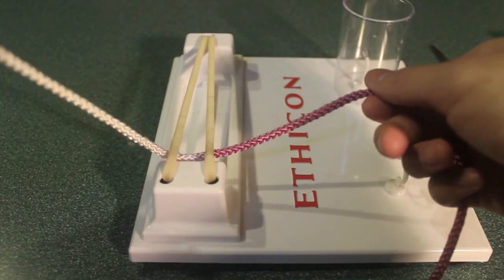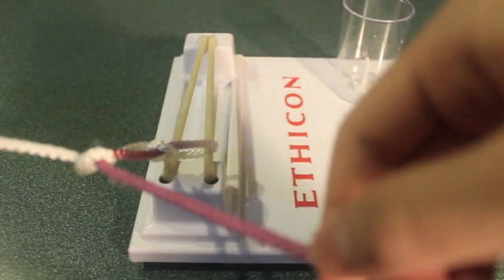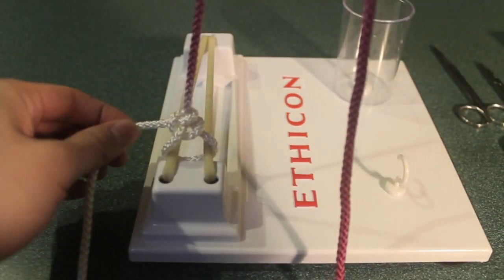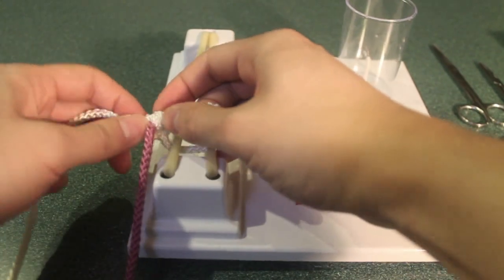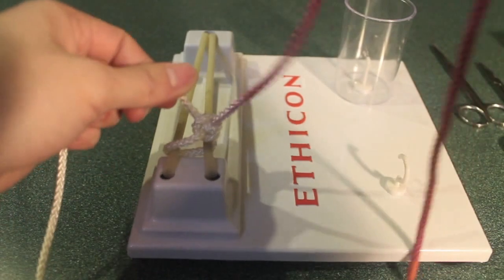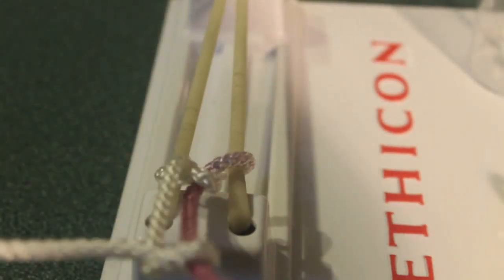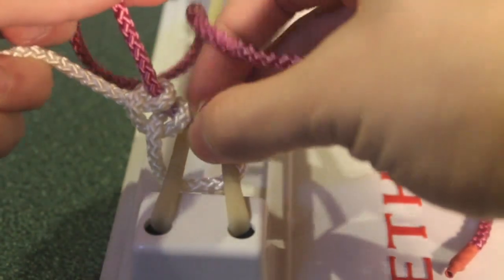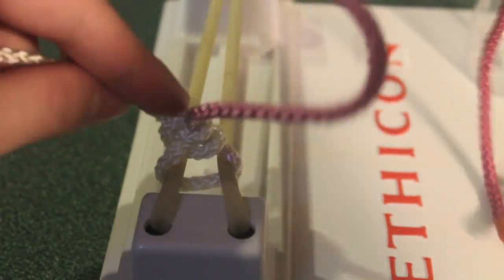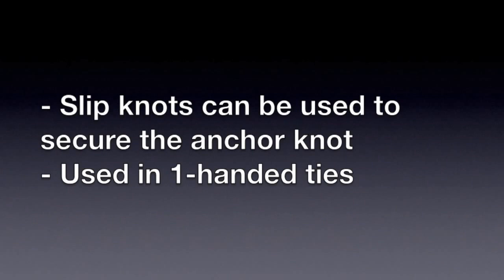Finally, we're going to learn how to make a slip knot. As you can imagine from its name, the slip knot has the ability to slide up and down along the axis of one end of the suture. There's an important distinction between the slip knot and the square knot that we'll learn about later when we learn how to make one-handed ties. The purpose of the slip knot is similar to that of the surgeon's knot, and it's used to anchor down your initial knot to ensure that it's tight, and it's used in one-handed ties.